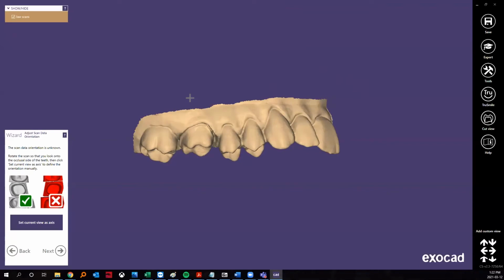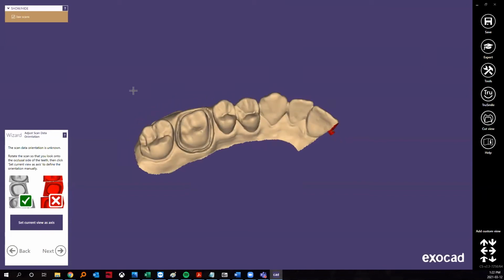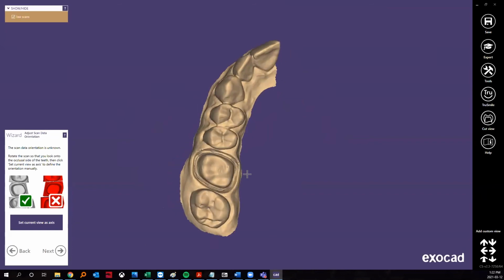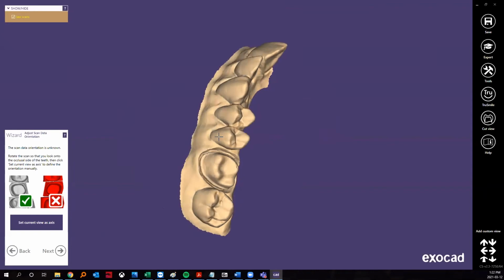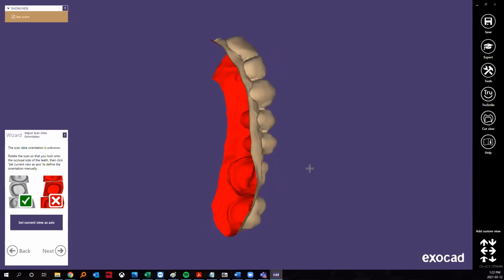All right. So from here, basically, as you saw, it just launched whenever Mike clicked on the CAD there. And we go right into basically the scan that we got. In this case, we don't have an opposing, so we're just going to work with the one arch, but we set the current view. This is basically the orientation. A lot of times, certain scanners and the software will not know the coordinate system that was used from what scanner. So when it's brought in, if ever it's brought in, you see the red, you're basically looking at the inside. And that's why we have this little kind of wizard box kind of guiding you.